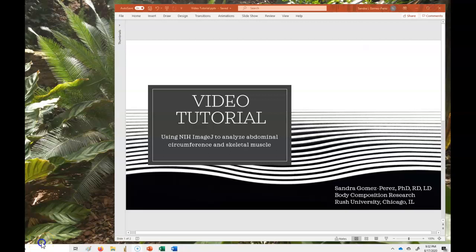My name is Sandra Gomez-Perez. I'm a body composition researcher at Rush University. This is a video tutorial that accompanies the tutorials we published in JPEN, and the tutorial focuses on using NIH ImageJ to analyze abdominal circumference and skeletal muscle.